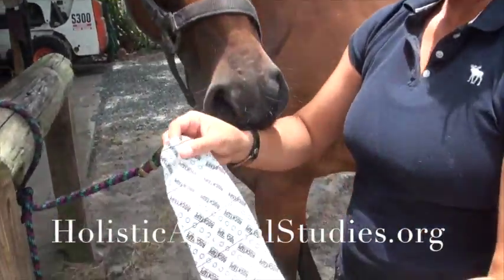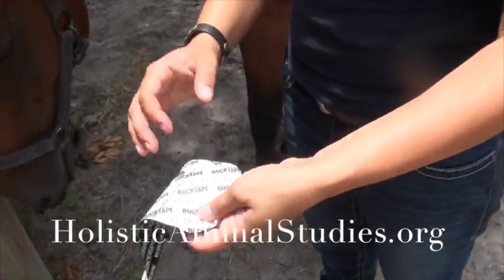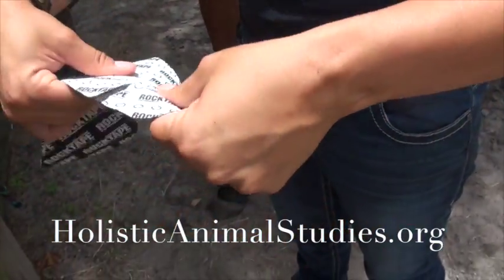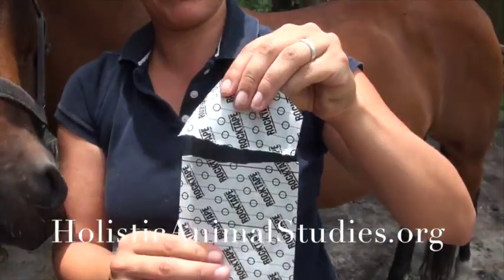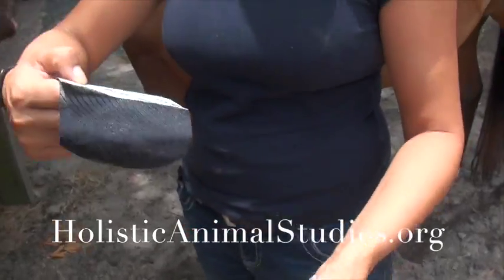The proper way to handle the tape is to tear the paper at the base. To tear it, I pull it like this — because the tape stretches along the longitudinal axis, but the paper does not stretch. So once we pull it that way, the paper tears. Then I pull off that piece of paper.